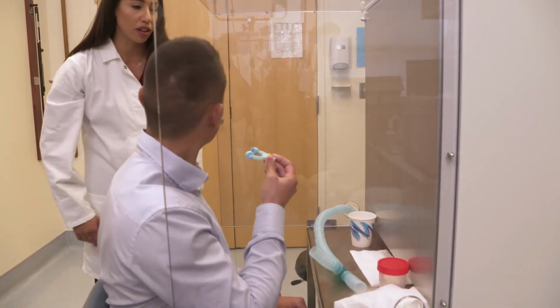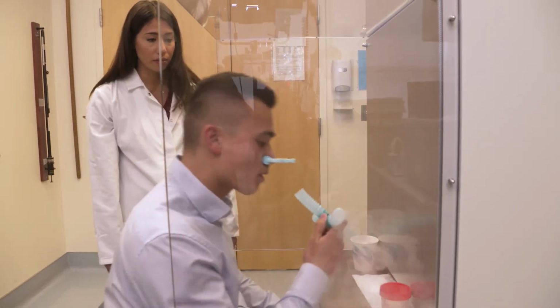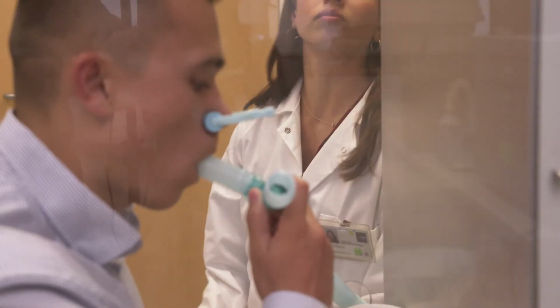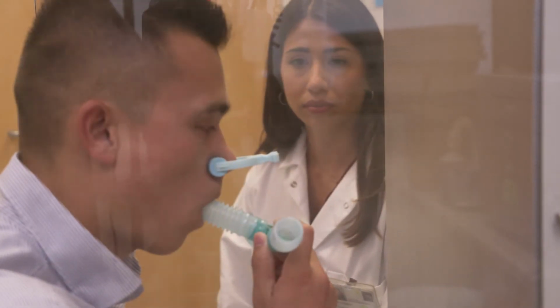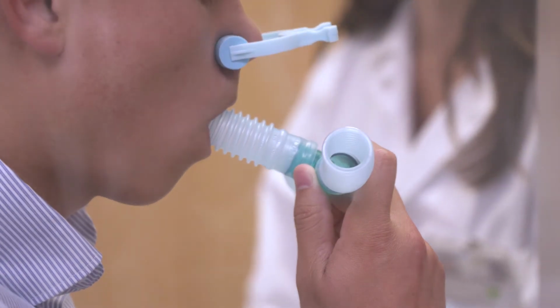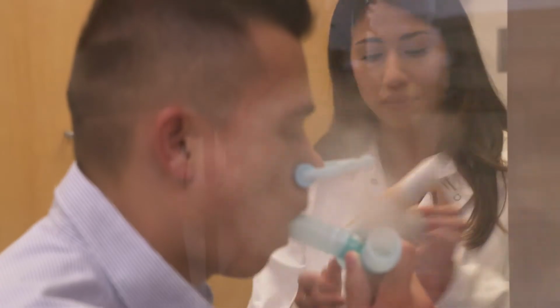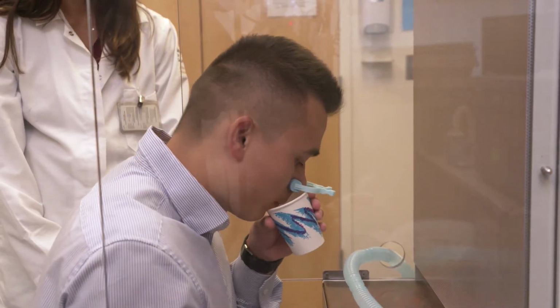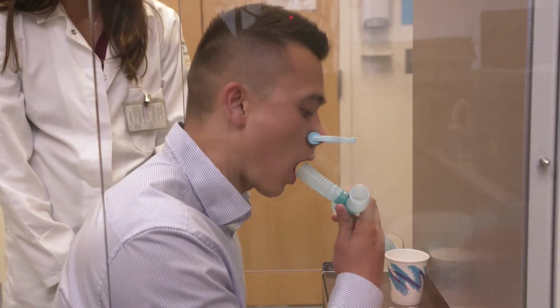All right, put your nose clips on. Great. And come onto the mouthpiece and begin to breathe regularly. That's great, just a few more minutes. Okay, good job. Come off of the mouthpiece, spit into the cup. Good, clear any saliva. That's great. Come back onto the mouthpiece and take 2 deep breaths.